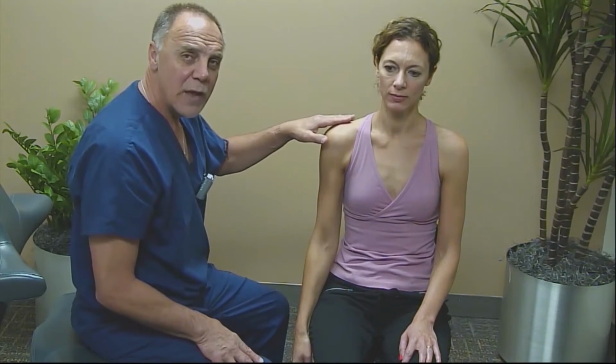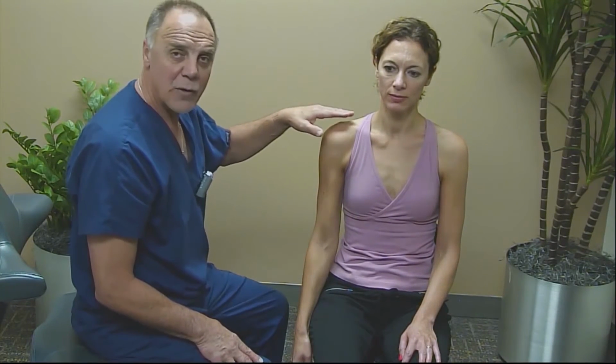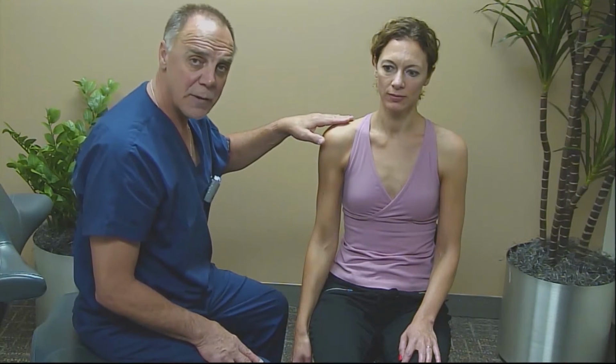What we're looking for in the AC joint is any type of underlying pathology or instability. So if we do see between the neutral and the cross-thoracic position any change in the position of the clavicle to the acromion, we may want to catch a dynamic clip of the patient putting their arm onto the contralateral shoulder and bringing it back down.